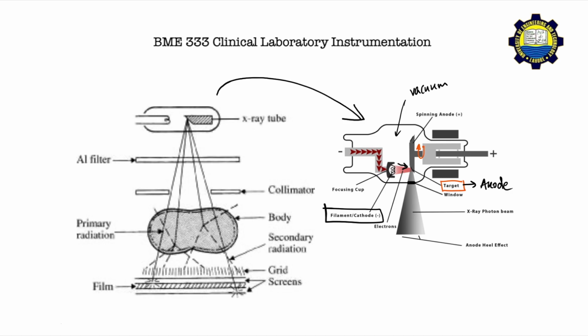Also, you notice in the diagram on the left hand side is an aluminum filter.